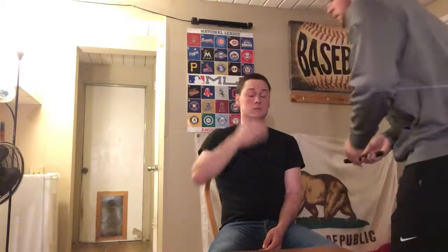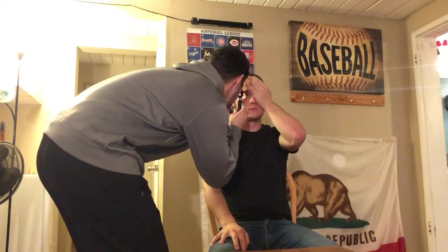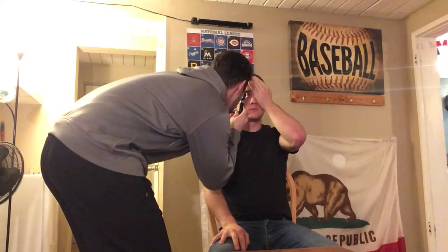All looks healthy. I'm going to switch sides. Do that other, yeah, refocus a little bit. Okay. Go ahead, look straight ahead. Same thing, optic disc here. Maybe a little bit of an angle, we can see that dark spot of the fovea. That will conclude that test. And that wraps up the portion of our eye exam right there for the general patient. Thank you.